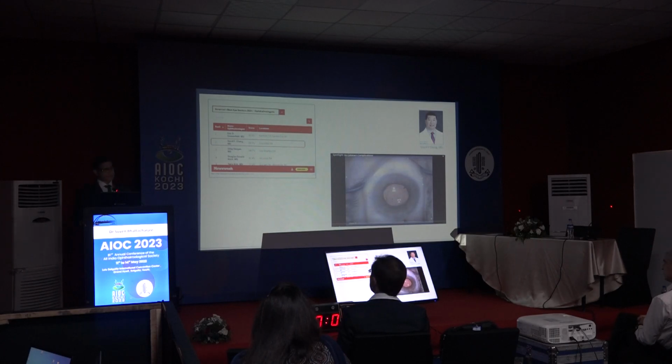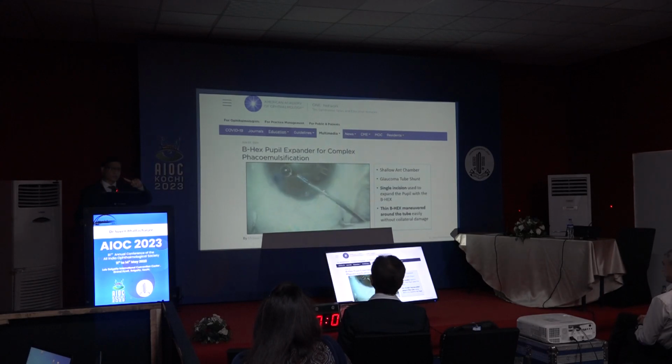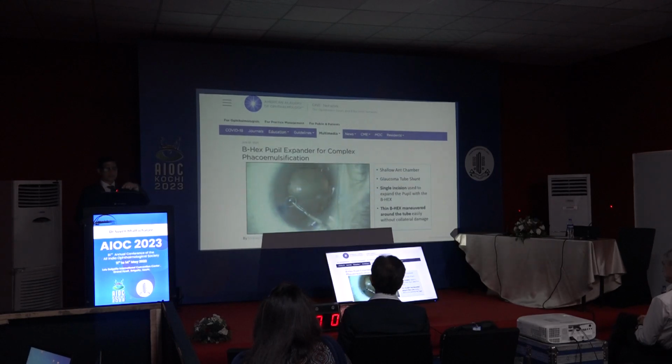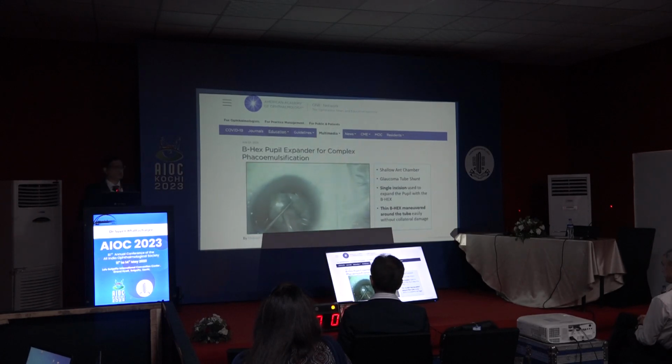So no better person than David Chang himself, the god of ophthalmology, and showcasing it in the AAO meeting is a real honor indeed. Of course, AAO has another video on its website, if you can look it up. It's a tube shunt surgery by Michael Henry and Deepak Edward. This is a wonderful surgery where you can see just one single port being used to tuck all the flanges, and there is a tube shunt over there, and this worked very well. So this has been watched many times in the American Academy. There you see that flange negotiating the tube shunt, and no device could do that. You won't have so much control with any device. Rest of the phaco is pretty simple.